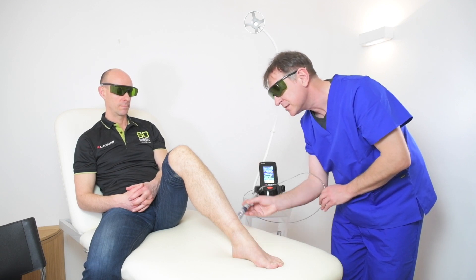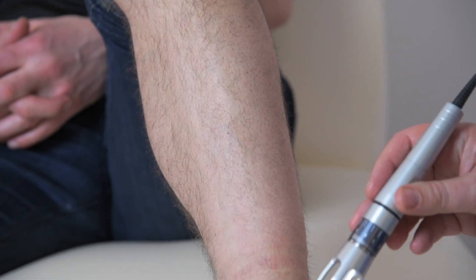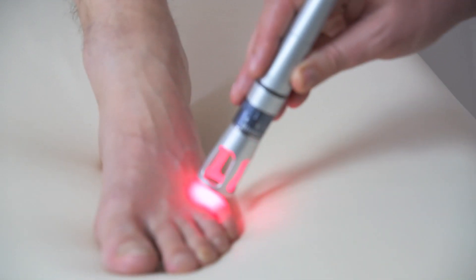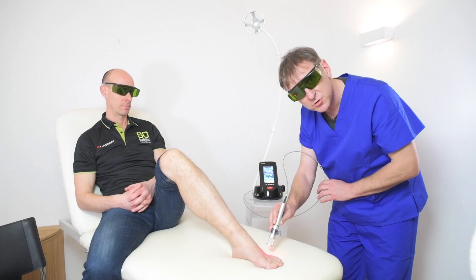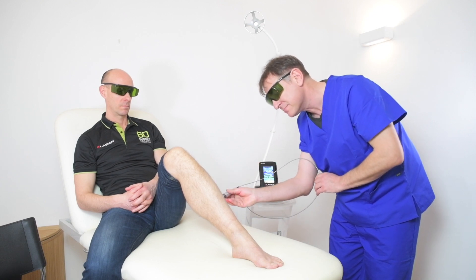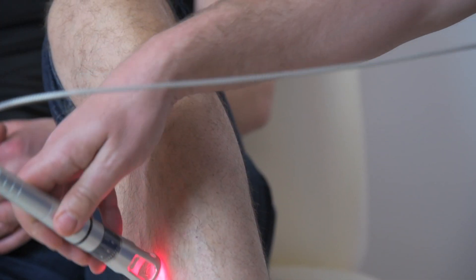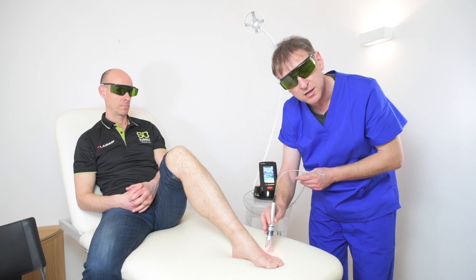The first six minutes of this treatment are purely working on the lower leg, and then the final treatment — which is usually only a couple of minutes — is actually over the wound itself. Just treating the wound itself would not have the desired effect. We need to make sure we are treating all of the lower leg, getting as much perfusion, as much collateral vessels and vascularization to enhance the perfusion of the lower foot before we work on the actual wound itself.